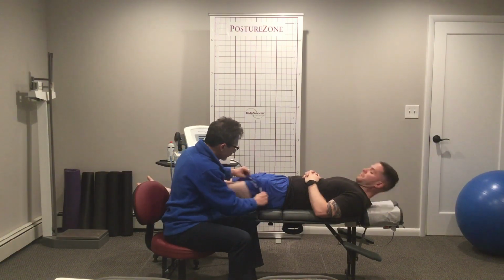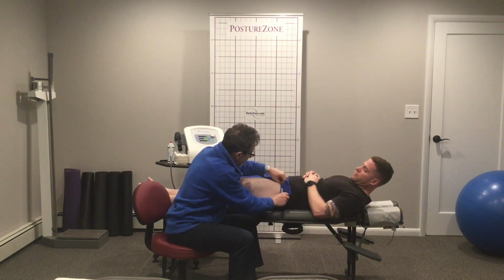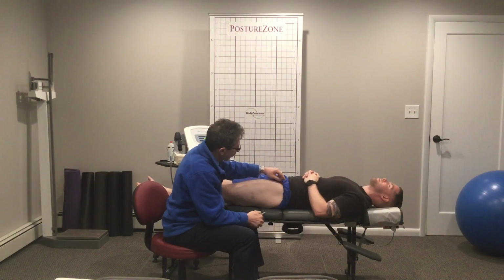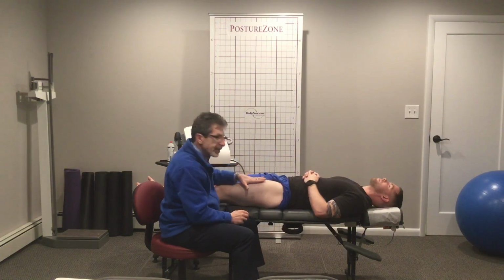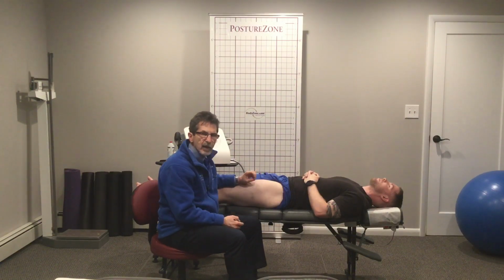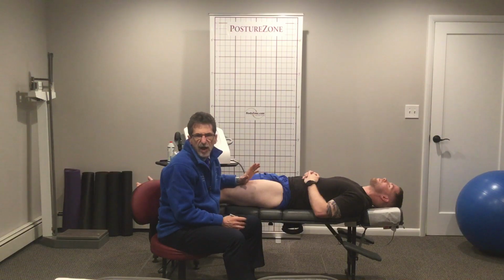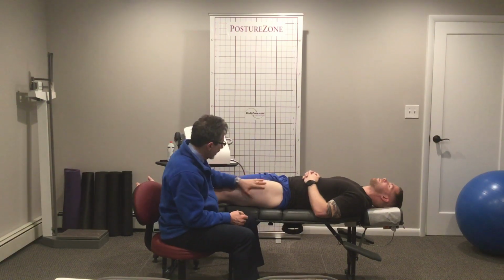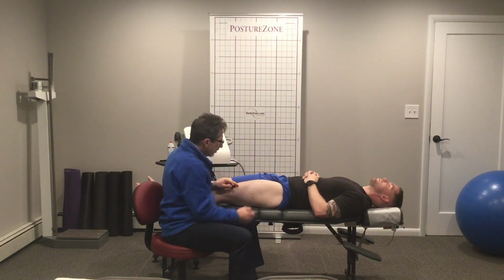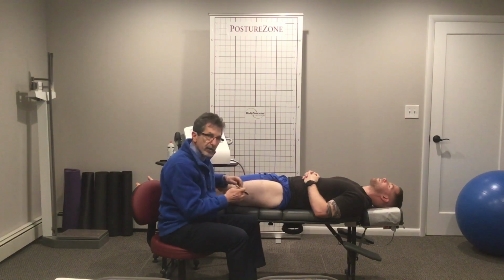So Mike, I'm just going to put your shorts up here a little bit. Give you a little sumo look. Great. So as I said, the rectus femoris comes all the way down. Let's say it was a relatively acute tear, maybe a grade 1 to 2, 25% of the fibers might have been torn, and it was in the belly of the muscle. So if the tear is here, we're not going to want to put a lot of radial therapy on that.